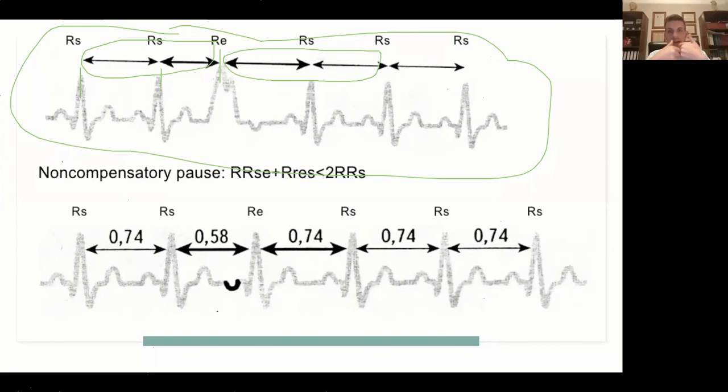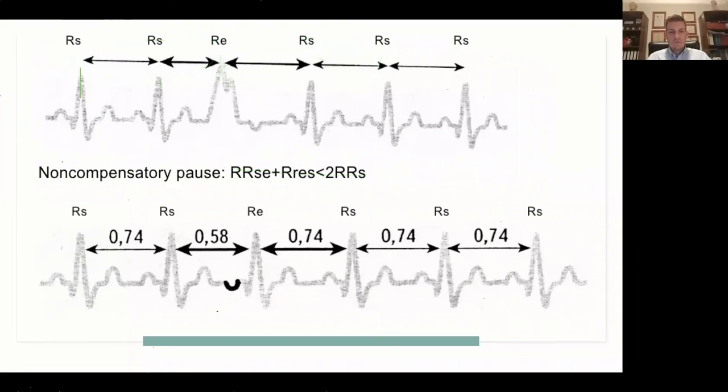Okay, can anybody guess, based on what we said, on the top strip, where the extrasystole occurs? Can anyone guess where the extrasystole occurs? Oh my mouse is really not cooperating at the moment. Just turn on your mics until I fix my... Someone turn on the mic that is sure. On the top part, where do you see an extrasystole occurring?